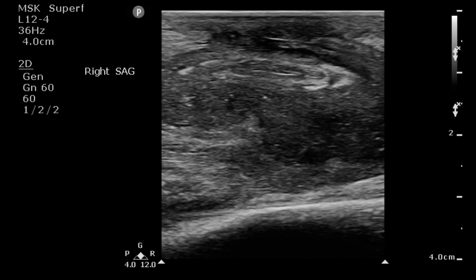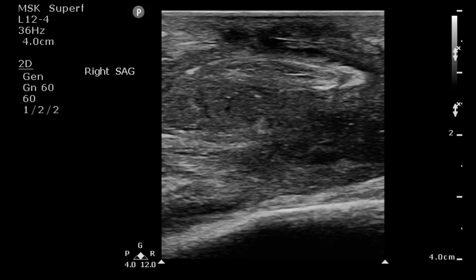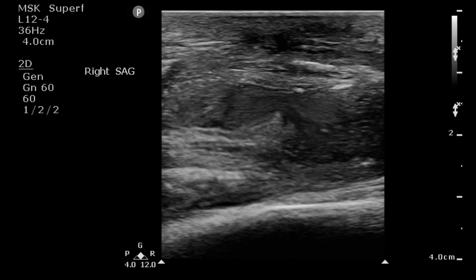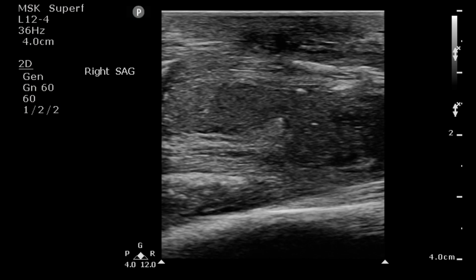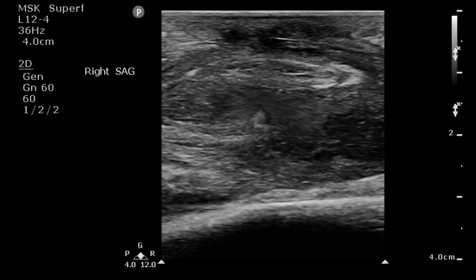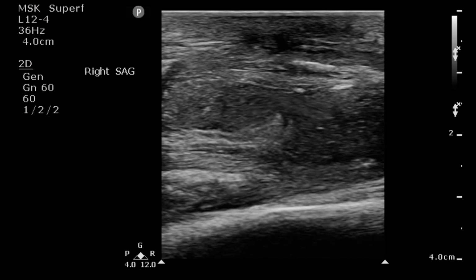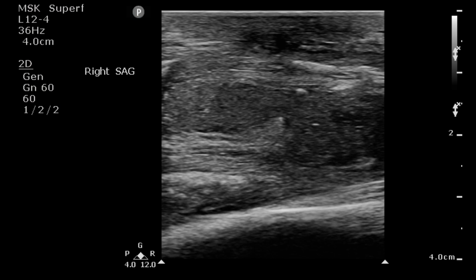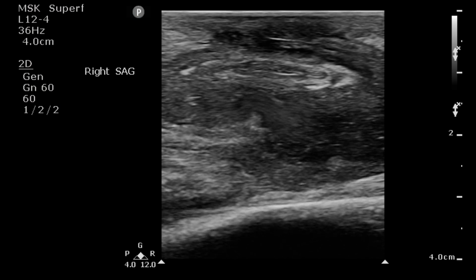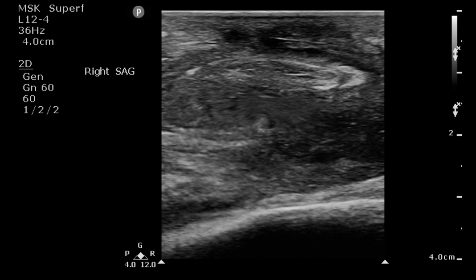well, if I know there's an abscess there, why should I bother to scan it, right? Why should I bother to look at it? I know what I'm going to do. I'm just going to do it. I'm going to drain the thing, right? And there's a decent argument to be made there that if there's an obvious abscess, from an evidence-based perspective, the ultrasound is not going to add anything when the outcome you're trying to add with the ultrasound is, is there an abscess there, right?